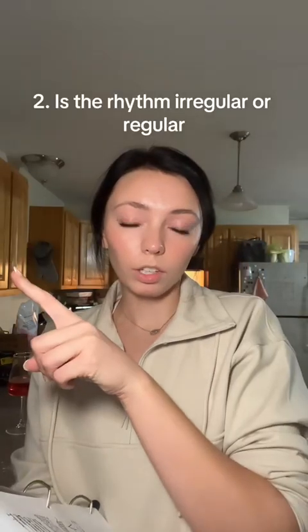Number 2, is it irregular or regular? Do I have to get my calipers out and actually measure? Do the complexes march out equally? If you don't have calipers, it's fine. I don't either. But if I see any irregularities, if my complexes are not even, if I see little clusters of complexes, do I see any weird spaces between them?